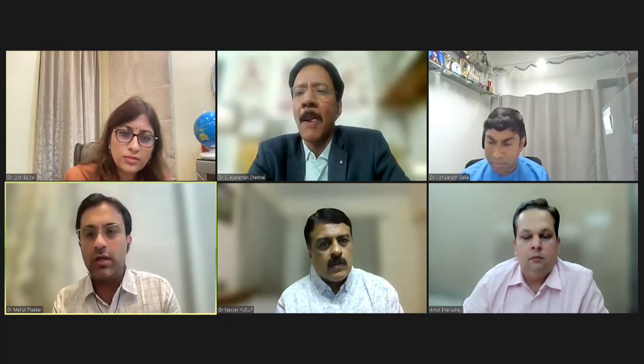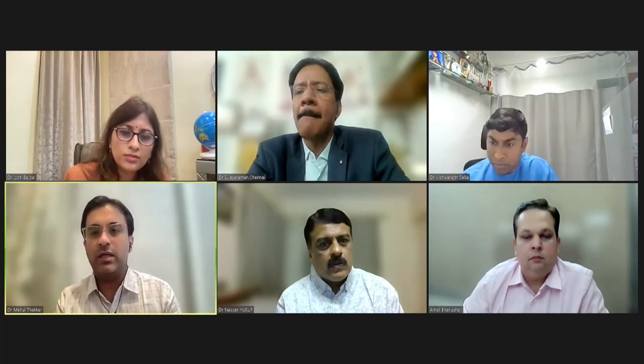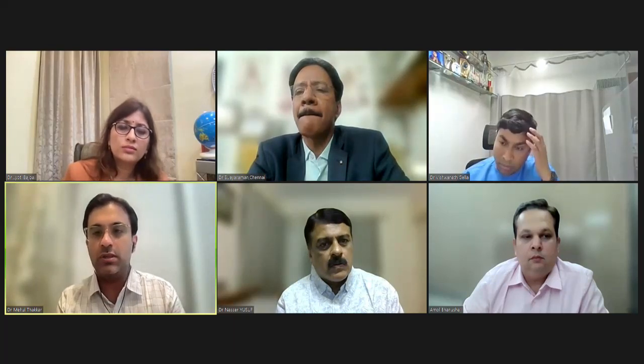And one comment by Dr. Sunita Narayan, theoretically, cryosampling shouldn't affect the nucleic acid amplification method, unlike in cultures with respect to tuberculosis. I'm guessing maybe it's the fast, rapid freezing and rapid thawing which is leading to the negative test. Does anybody have any other idea why the nucleic acid amplification tests are negative?